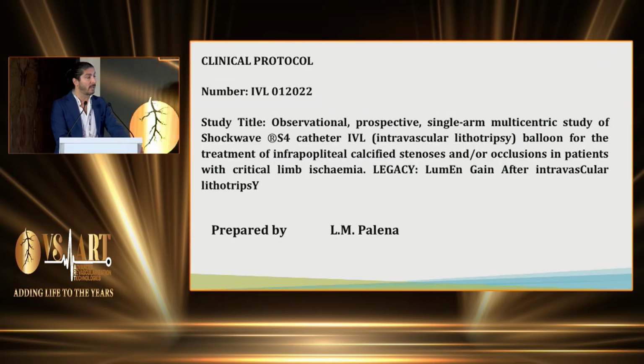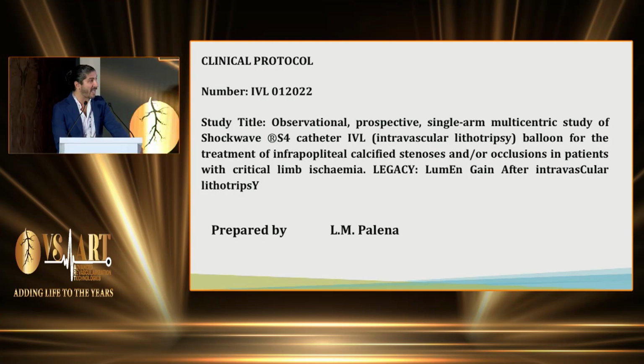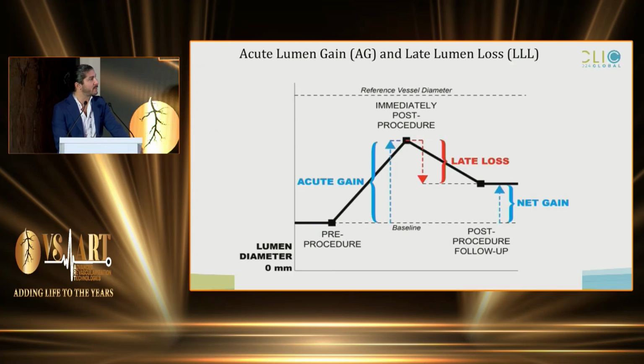But we have some other technologies. This is a trial that Bruno is participating in about shockwave in below the knee, to understand how much lumen we can gain with the technology. This is the concept of lumen gain, the net gain. We check the vessel before using shockwave, after shockwave, and after 15 minutes before finishing the procedure.